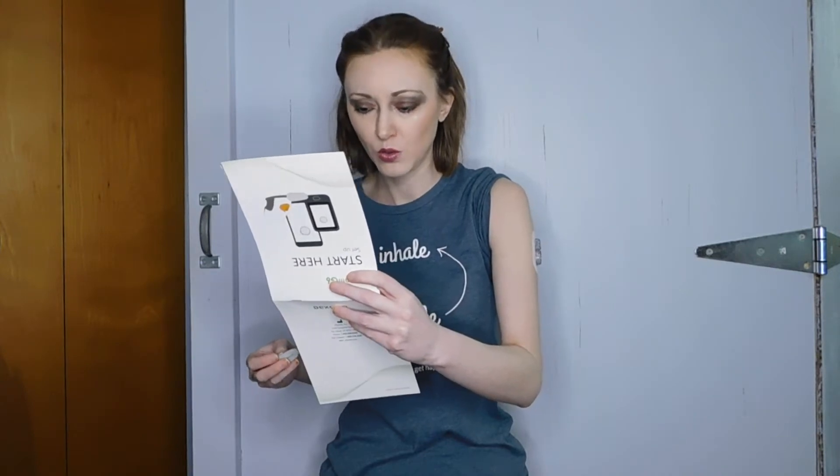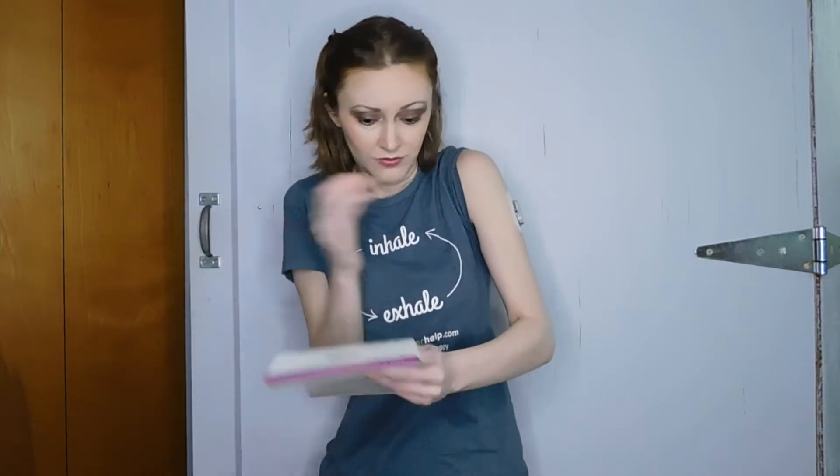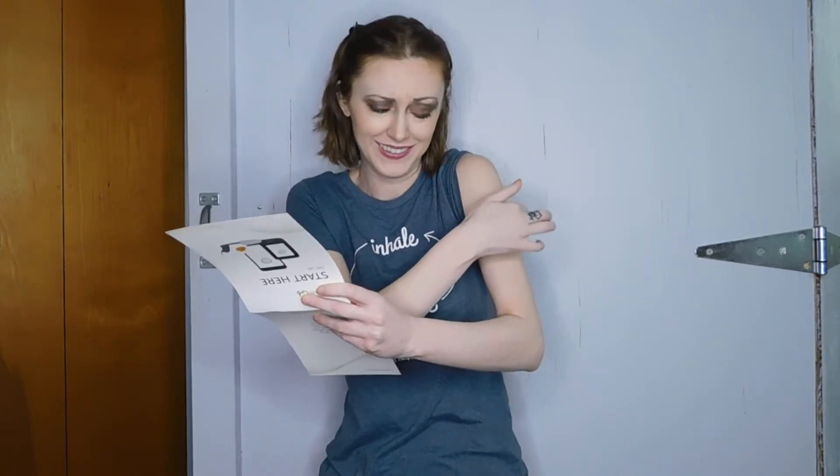Throw away applicator. Snap in transmitter. First impressions — it's fine. I can still move my arm. It's a little bit sore, like I just got a flu shot. Insert transmitter tab first into holder. Snap in transmitter — it clicks into place. Rub around patch three times. One, two, three.